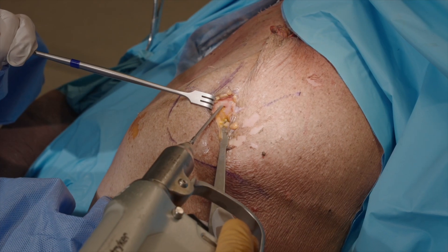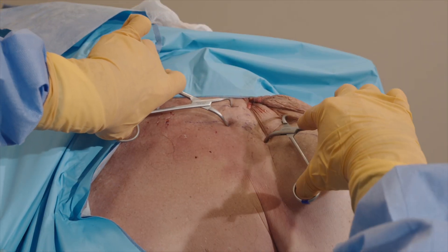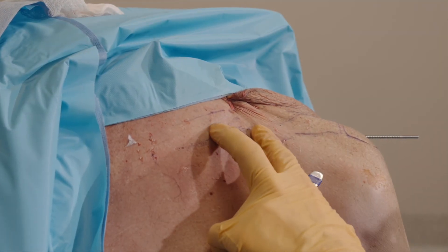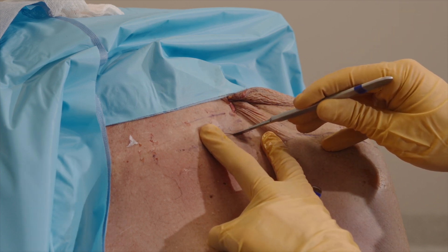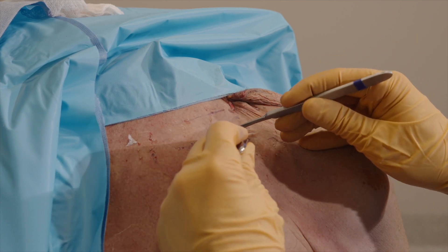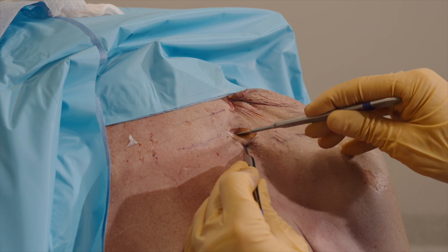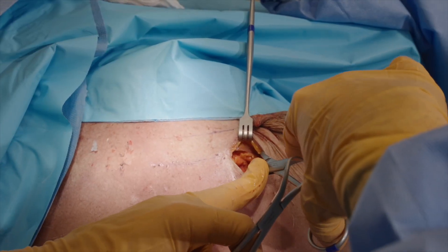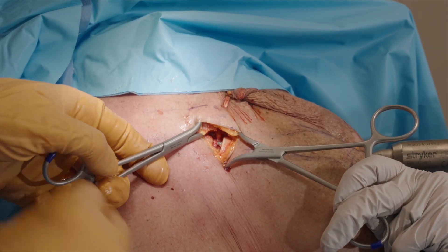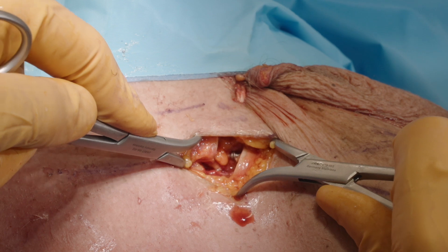Use the universal powered pin driver to advance the Anser clavicle pin until the fracture site is reached. Reduce the fracture elements and align them percutaneously using reduction clamps and reduction maneuvers. If closed reduction attempts are unsuccessful, make an accessory two to three centimeter incision over the fracture site. Do not use the Anser clavicle pin as a lever or joystick during reduction — it may deform or break. Consider closed reduction if the fracture has a simple pattern and is being addressed within three to four days after trauma. In all other cases, there is a low threshold to open the fracture site and reduce the fracture under direct visualization. This makes the reduction and procedure reliable, quick, and safe. Little to no soft tissue stripping is necessary and research shows it does not negatively impact union rates. Lobster claws tend to be easiest to use during reduction.